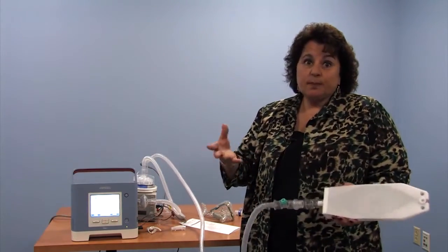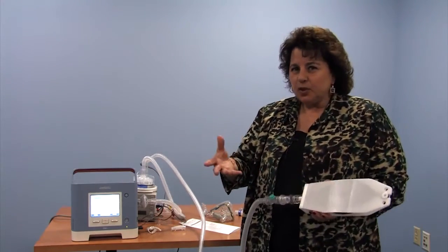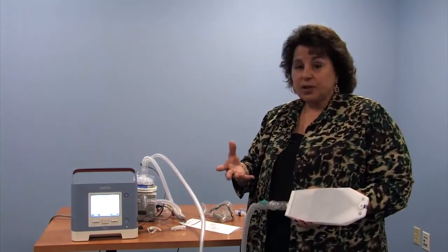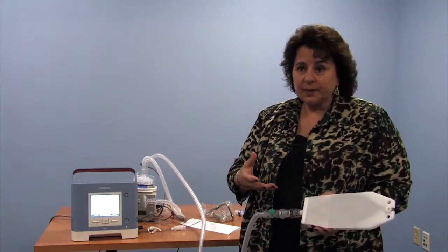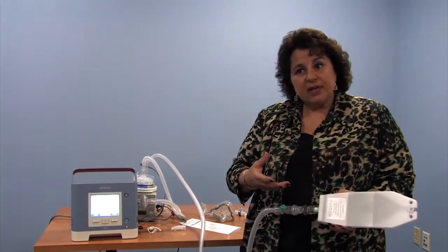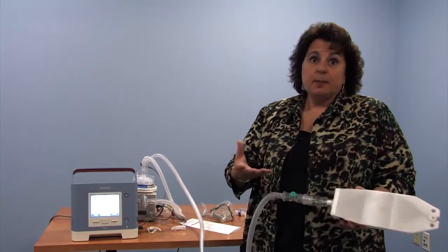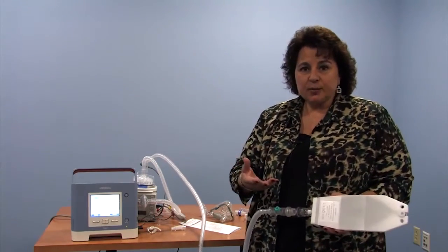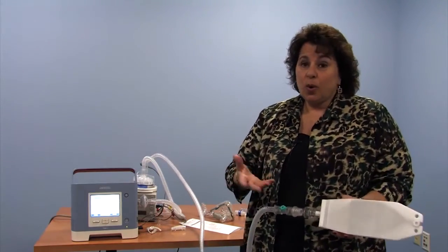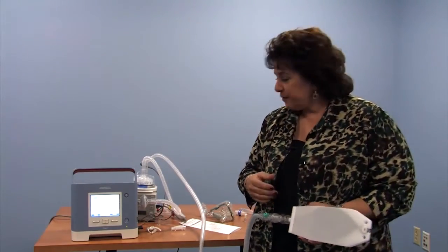Now you might say, well, I'll have my machine with me and they can look at it. That's true, but the place that you go, perhaps they don't understand the Trilogy or they're not comfortable with reading off of it. That's a possibility. Also, many children are on support at night, and they might come to the hospital for a medical appointment, but lo and behold, something required them to stay. So your equipment's at home, and now you're at the hospital and you don't have your machine, and people are asking you, well, what kind of support is your child on at night? So it's nice to have a picture of it in your smartphone.